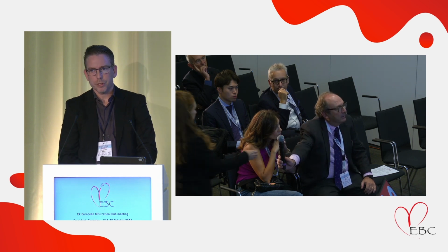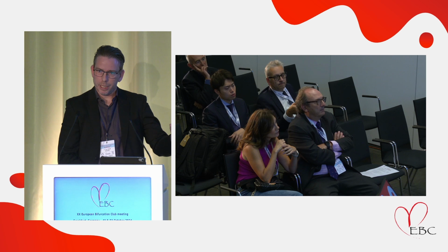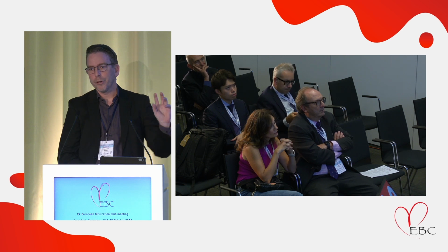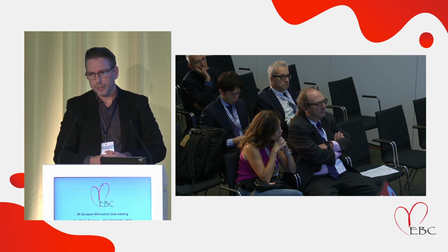Yeah, so I believe that if it was identified by physicians, it was mandated to correct it, and it was done actually in the vast majority of those cases. But we have a core lab evaluation afterwards where we saw that about half of those, the true numbers, were not identified by the physicians and were not corrected. And it's also by protocol, we didn't contact the centers and ask them to bring in the patient again for correction, as then we would start to affect the outcomes. So we saw something in the core lab where, okay, you get sweaty hands, the patient is left out there with a severely distorted stent that was not identified by the physician.